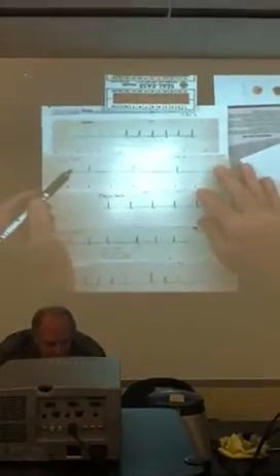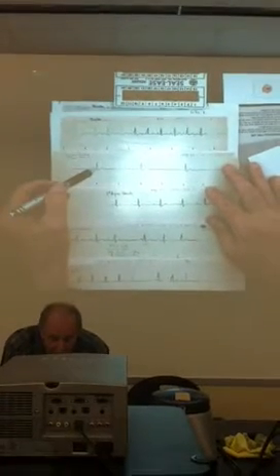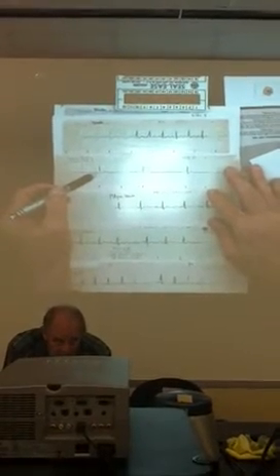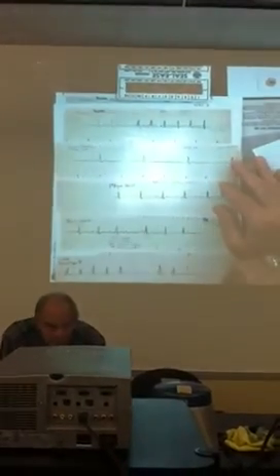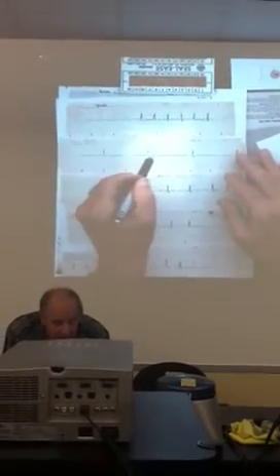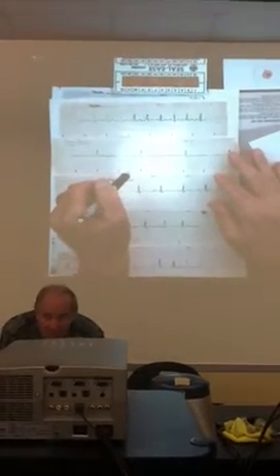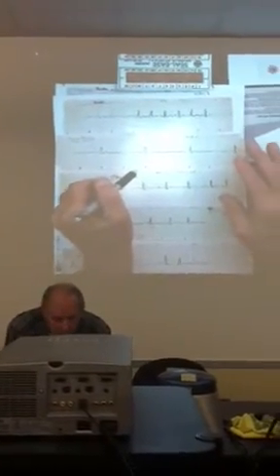All right, so we got 30. How did we get 30? Everybody know that? Count these R peaks. If you can't remember this, write down the formula: count the number of R's in a 6-second interval and multiply by 10. See what I mean?